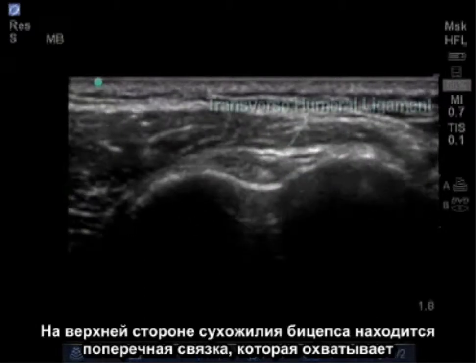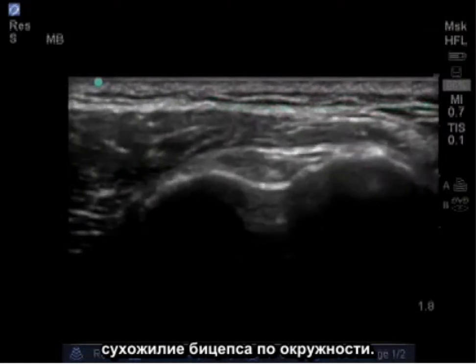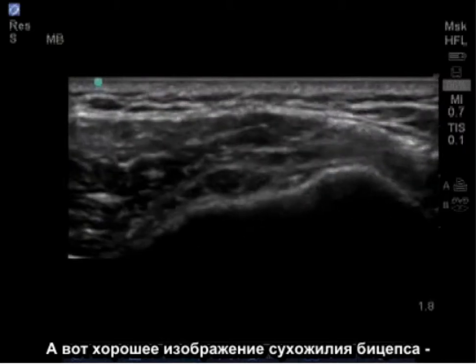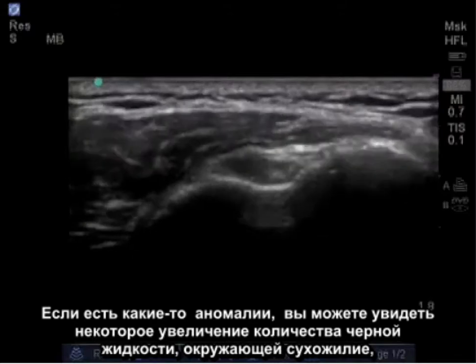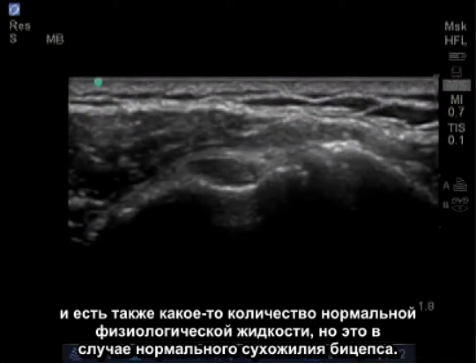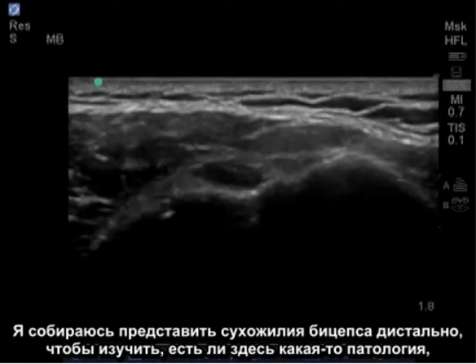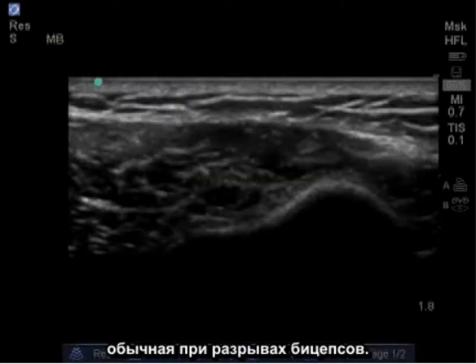On top of the bicep tendon lies the transverse ligament which covers the bicep tendon in its circular pattern. Here is a good image of the bicep tendon in its cross section. If there are abnormalities, you may see some increased black fluid surrounding the tendon. There's some normal physiologic fluid there, but this is a normal bicep tendon. I'm going to follow the bicep tendon distally to examine if there's any pathology, which is a common place of bicep tears.